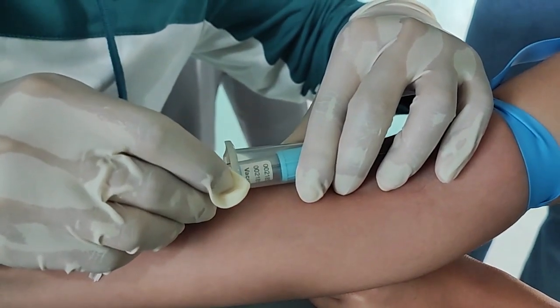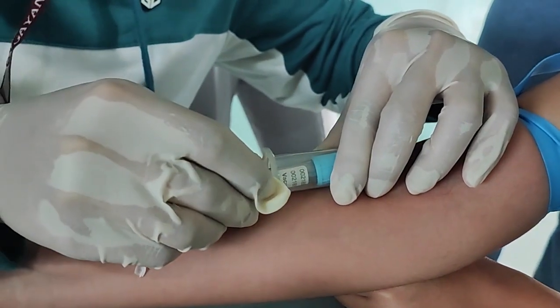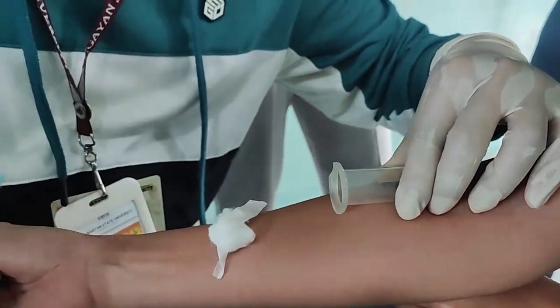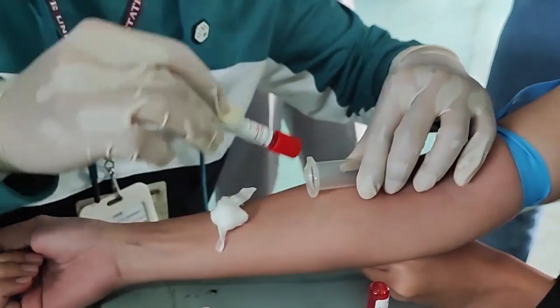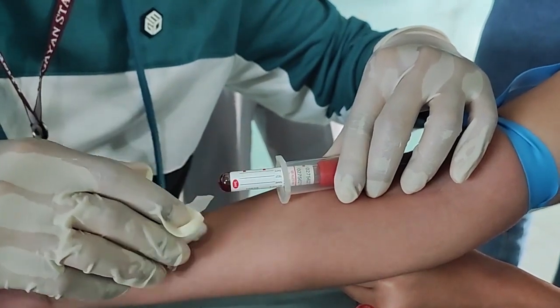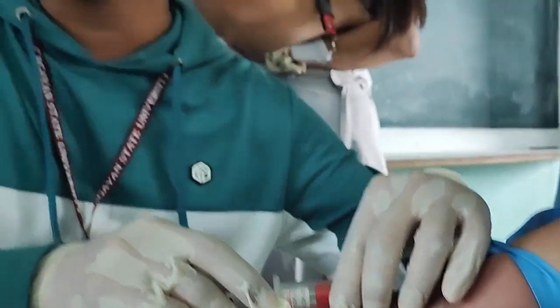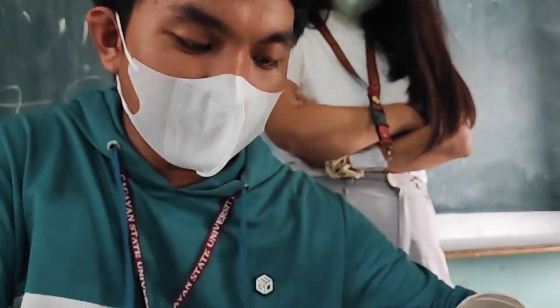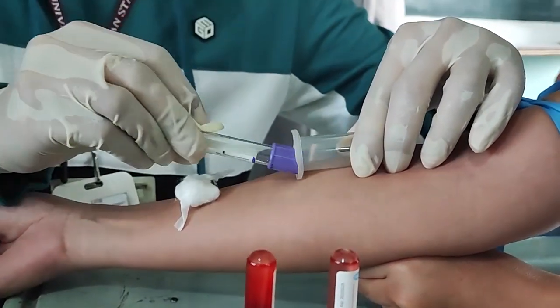Yan po. And since ayan, ubos na po yung vacuum niya. And then tatanggalin na po natin and then we're going to invert it for 4 times. And then next naman po na gagamitin natin is itong red. And dito po sa red, according po sa pagkakaalam ko, hindi naman na po to necessary na pupunuin or wala po siyang certain na amount na fill. And then the next one naman po is itong lavender top natin.